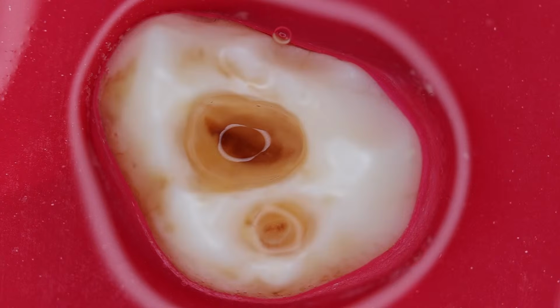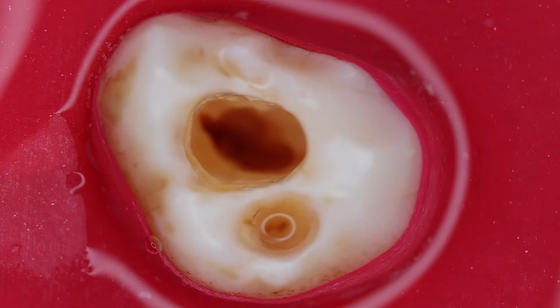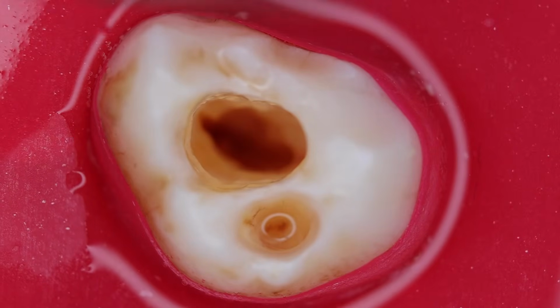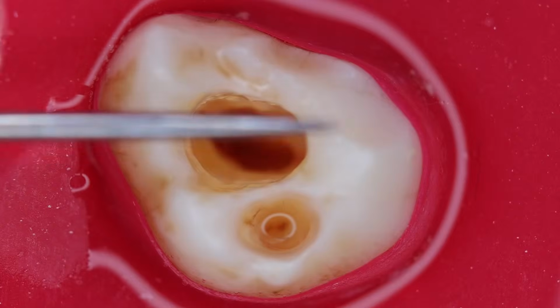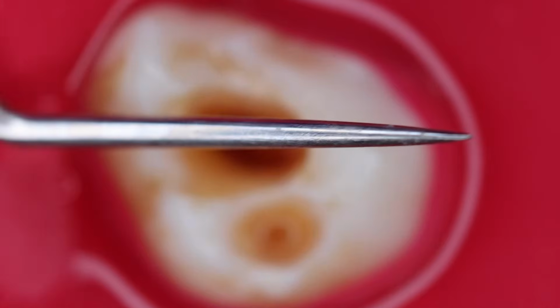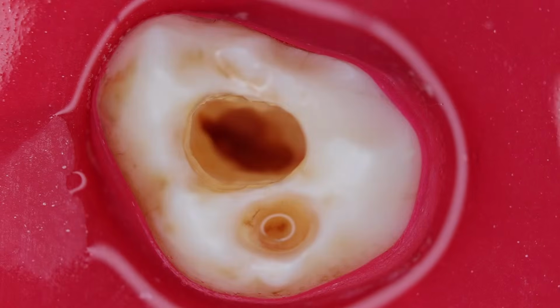Once you have defined the access cavity shape, as you can see now, this is the time you will introduce the DG16 probe. So this is the DG16 probe. And let us explore the canal orifices.